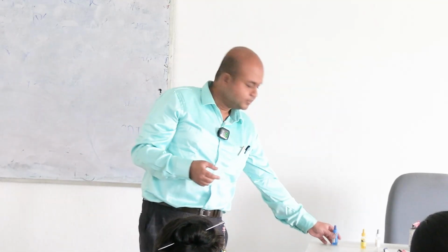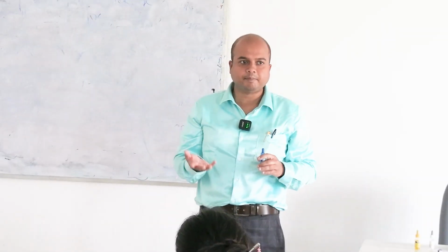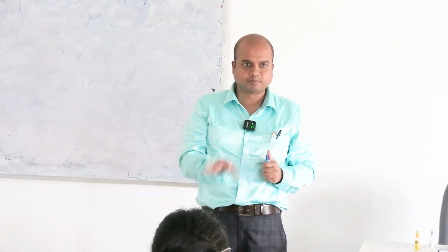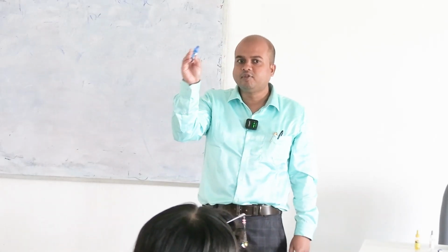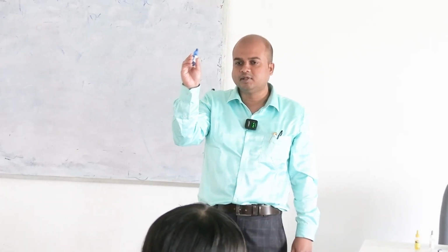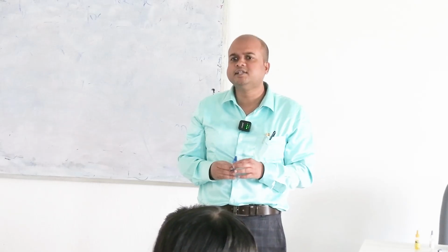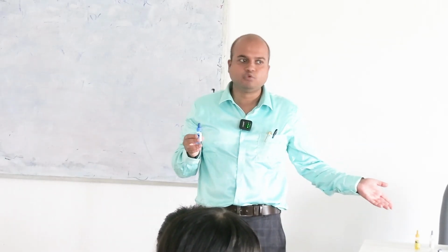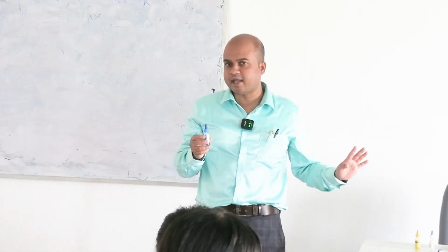If this is mixed with the individual's blood, whose blood type is unknown at this point and I want to determine it, then if the antigen present on the surface of the RBC in that individual is A, an agglutination reaction will be observed. It can usually be observed with the naked eye.